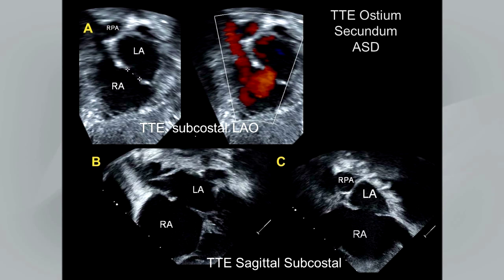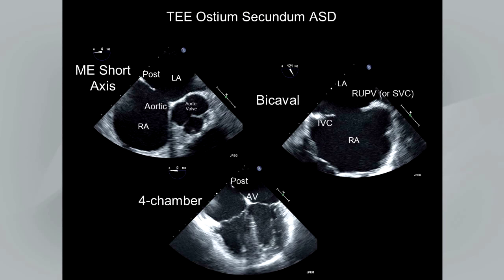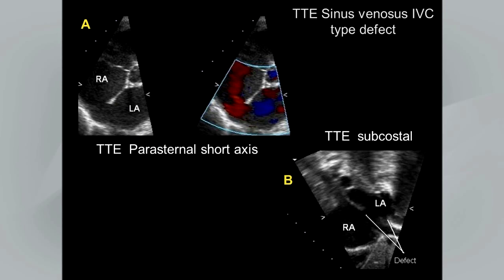Another pediatric patient example in the subcostal LAO and sagittal subcostal views shows a moderate-to-large ostium secundum ASD with left-to-right color Doppler flow. A transesophageal echo example demonstrates key views used to define the rims and the defect: a mid-esophageal short axis view on the upper left, a bicaval view on the right, and a four-chamber view on the bottom. These show the posterior and aortic rims in the short axis, the right upper pulmonary vein and inferior rims in the bicaval view, and the posterior and AV valve rims in the four-chamber view.